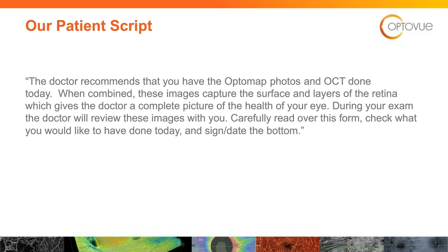When combined, these images capture the surface and layers of the retina, which gives the doctor a complete picture of the health of your eye. During the exam, the doctor will review these images with you, carefully read over this form, check what you would like to have done today, sign and date the bottom. It's pretty much that simple.